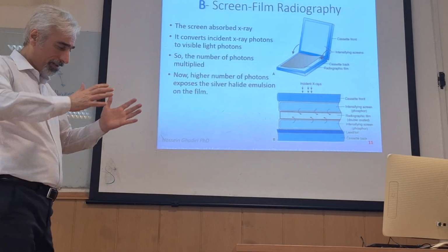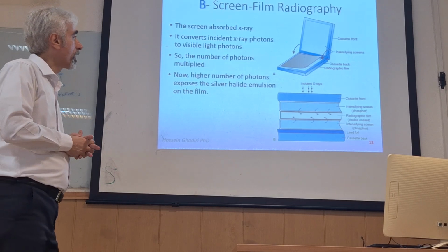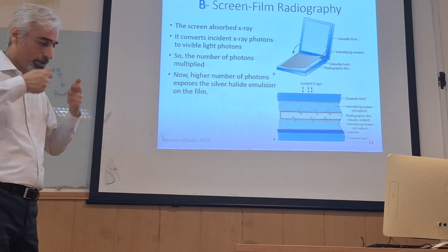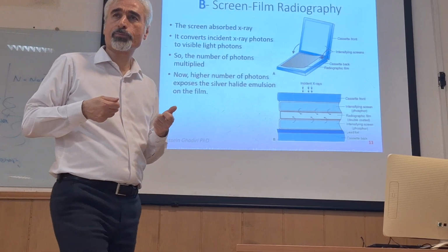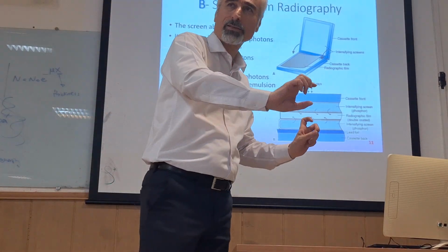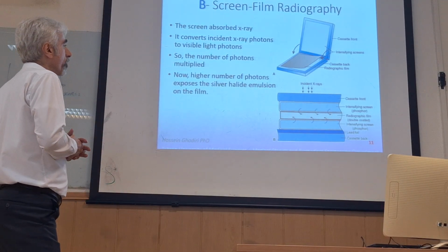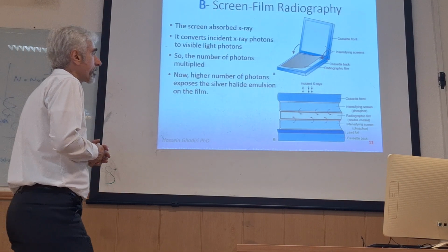So this lock and the design is very important. After closing it, we take it and put it inside the slot under the patient body and use it for scanning.